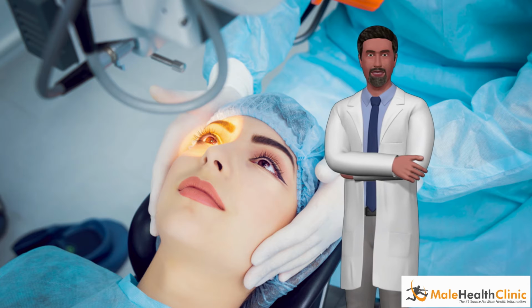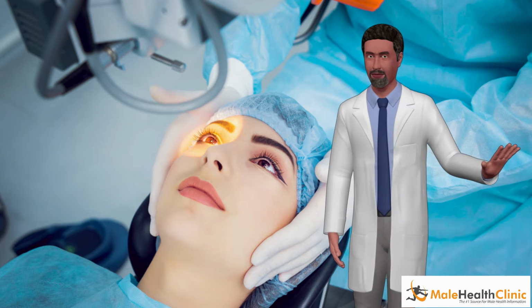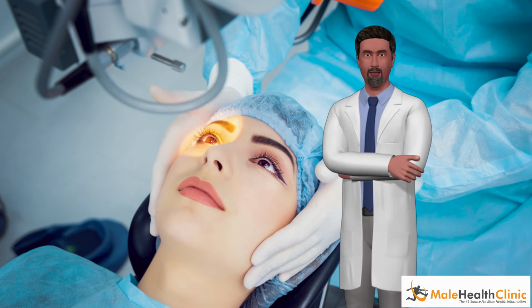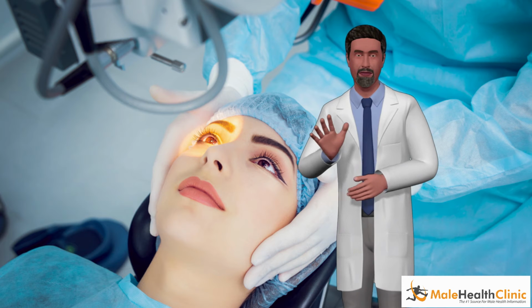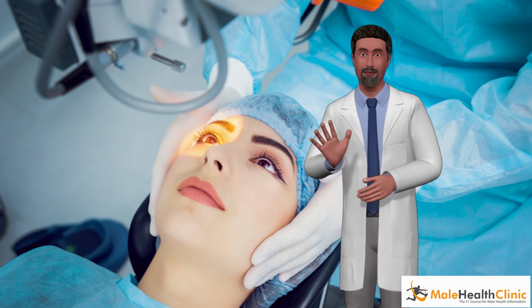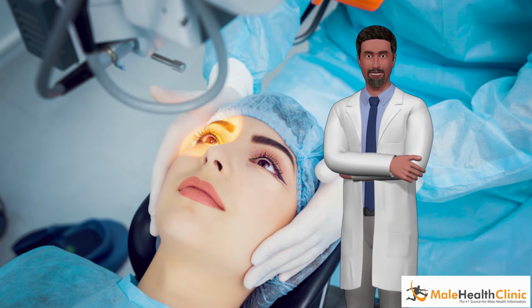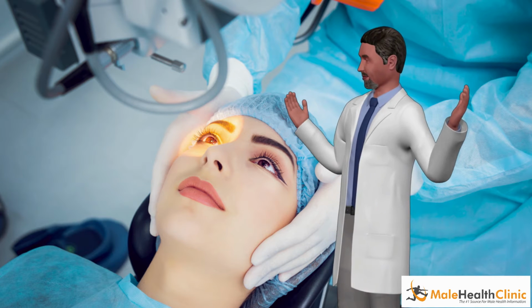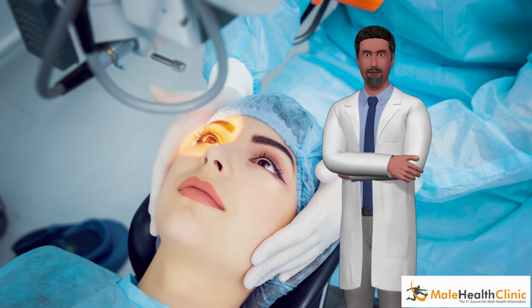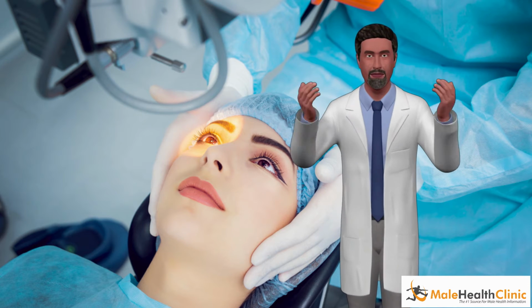In a perfectly formed eye, light entering the eye bends and directly hits the retina, allowing the eye to produce a clear image. The majority of people, though, have imperfectly shaped corneas. Imperfectly shaped corneas do not properly refract the light on the retina, with the result that the viewed image is blurry and distorted. LASIK can correct these refractive errors by permanently changing the shape of the cornea. Once reshaped, the cornea is able to better focus light, eliminating the need for glasses or contacts.